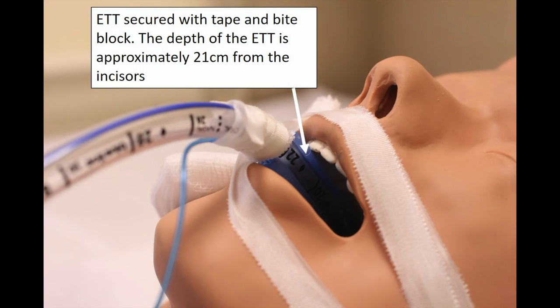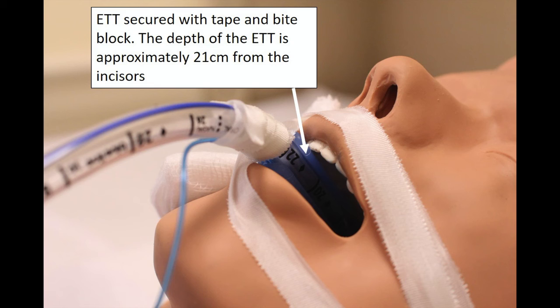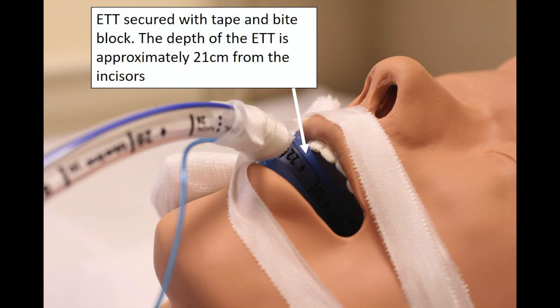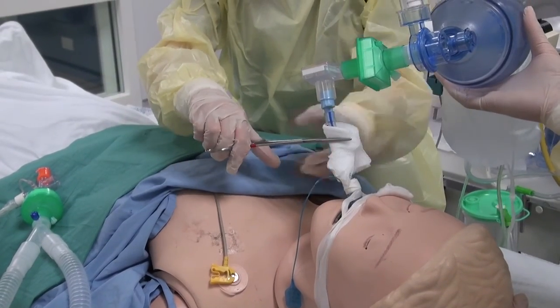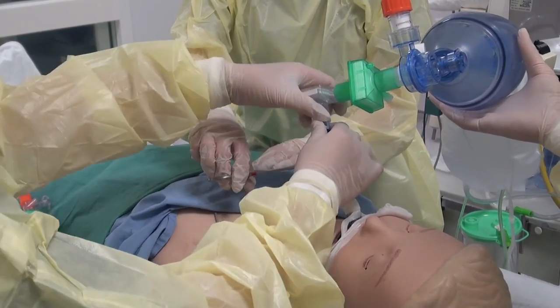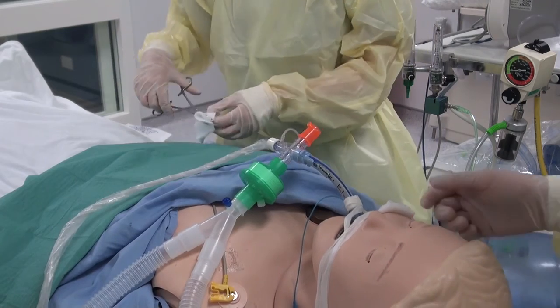During the entire intubation procedure, it is crucial to maintain the endotracheal tube in place. Immediately after intubation, the depth of the endotracheal tube should be noted. Generally, the endotracheal tube depth is usually 19 to 22 centimeters in most adult patients. Before connecting the ventilator, clamping the endotracheal tube with gauze helps to minimize dispersion of respiratory droplets and aerosols. This is recommended for patients with COVID-19. Notice that the inline suction and HME, or ETCO2 adapter if used, are already pre-attached to the breathing circuit.